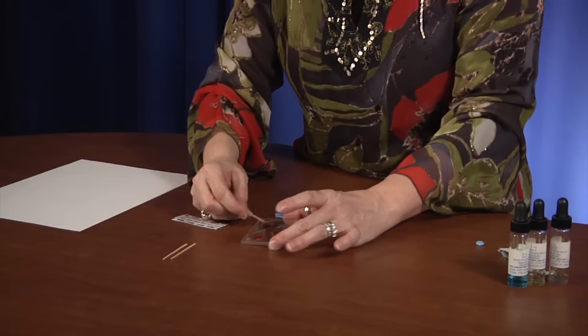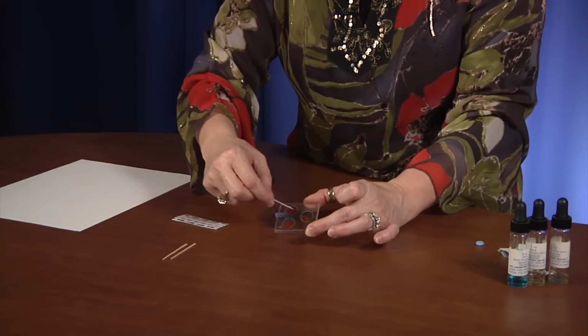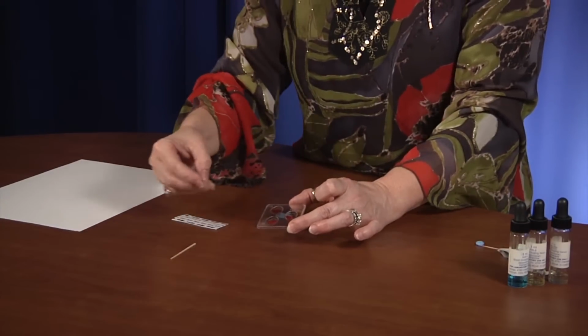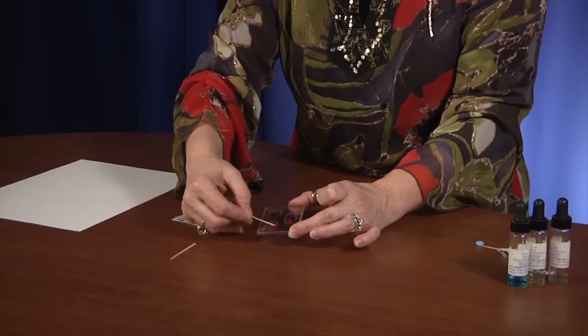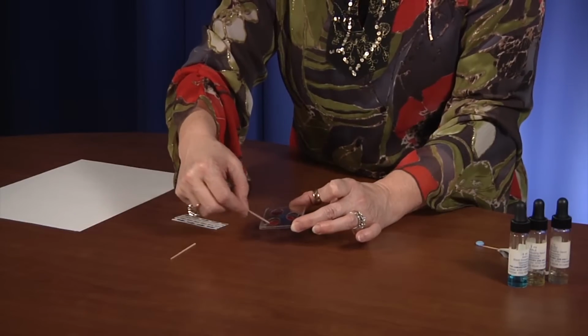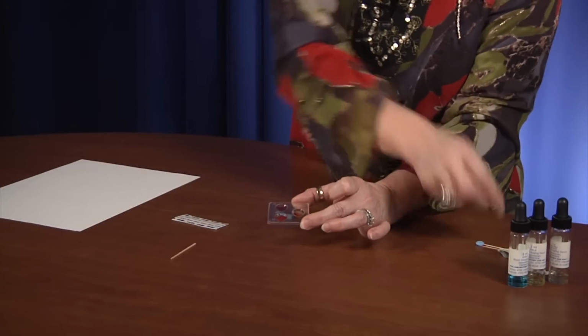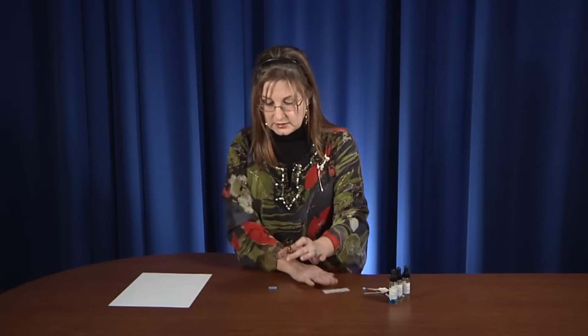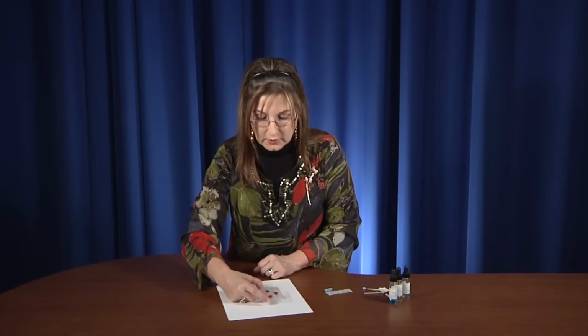Now, using those toothpicks, take the end of the toothpick and stir the contents of that well. Put that toothpick to the side so that you don't use it again. Take a clean toothpick and stir the B, making sure you mix well. Discard it and take your 3rd toothpick and mix the RH well. Now, at this point, I'm going to put something light colored underneath it so that you can see the reaction better. And I will rock this tray back and forth a bit just to make sure that it mixes well.